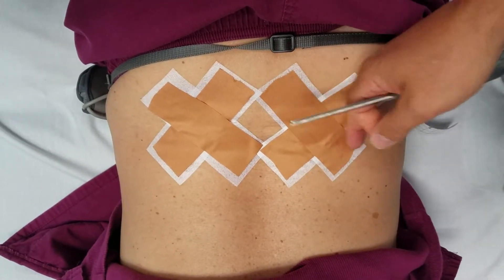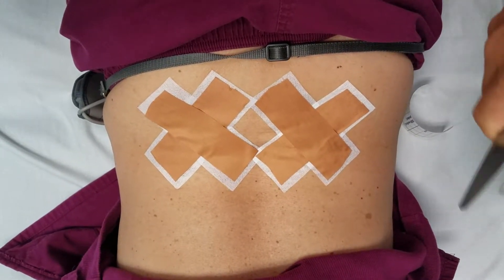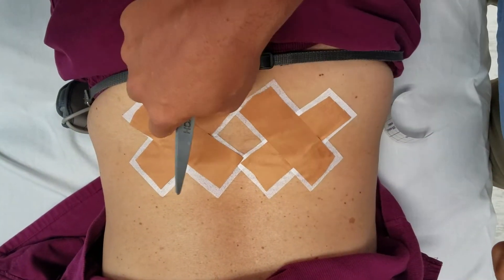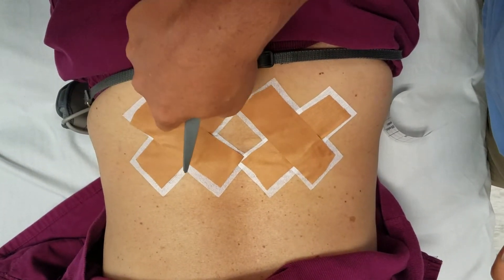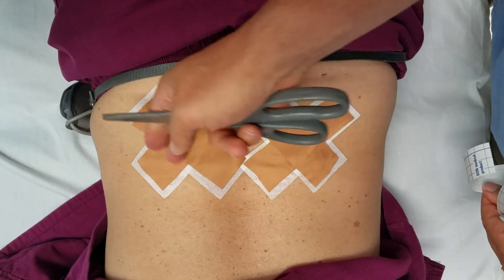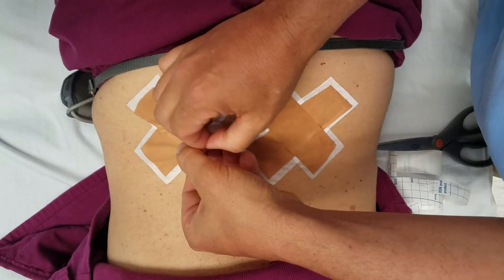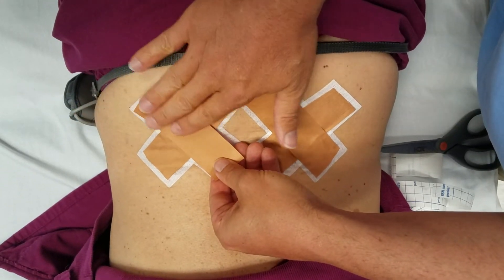This tape will last about a week each time and can be changed out every week. We use cover roll stretch and Leukotape — both by BSN Medical. The reason we use the cover roll is because the Leukotape tends to irritate and tear the skin. So we protect the skin, keep it safe, and allow the patient to keep using the tape for an extended period — easily over a week at a time without irritating the skin.